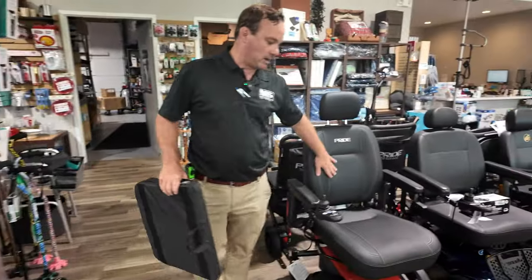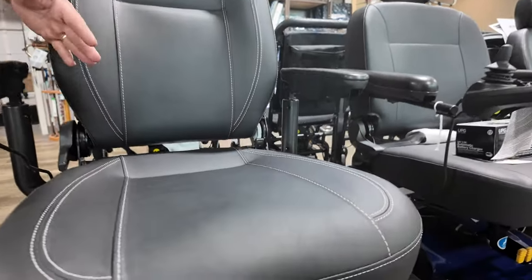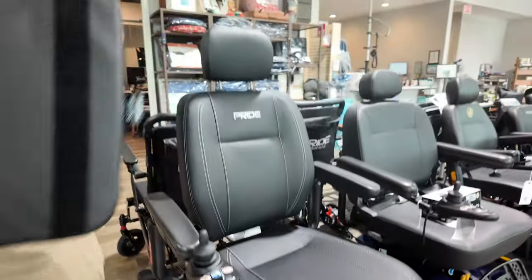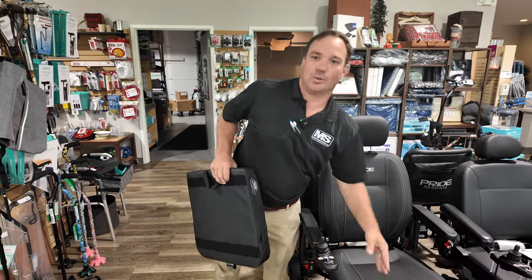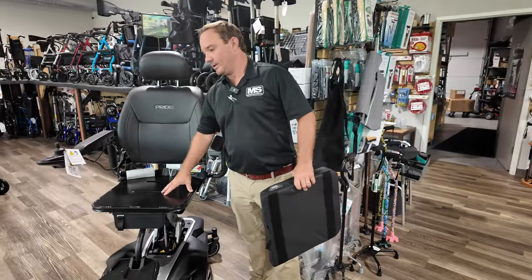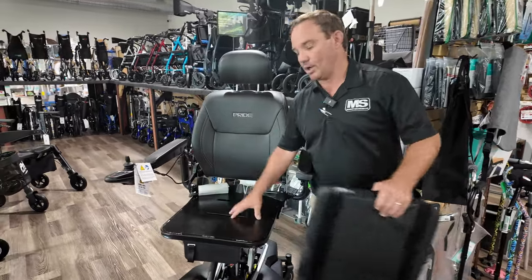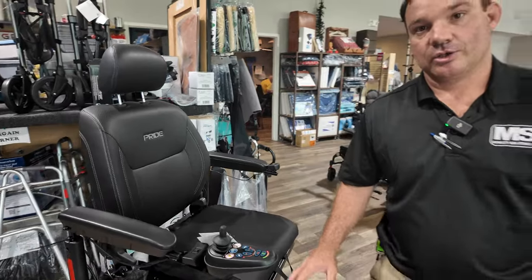Most chairs have what we call a contour seat — a high back contour seat. You can still put a cushion in here but it's going to make it a lot higher, which could benefit someone. This is the standard, so maybe it's too firm for someone, and you would go with the solid seat if someone wants to change the cushion out — if they want a softer or firmer seat, or have a customized seat.